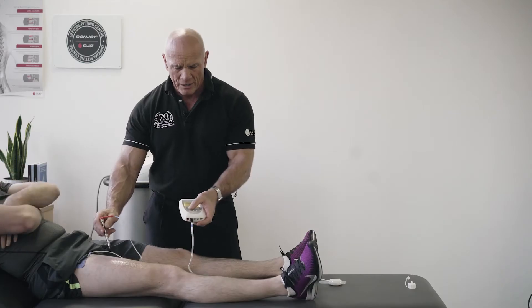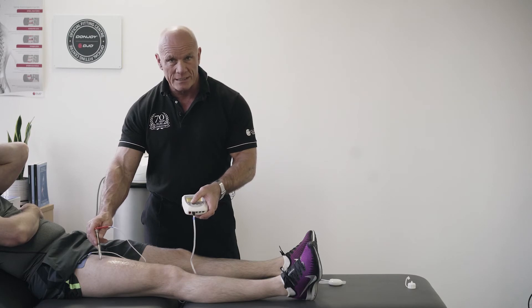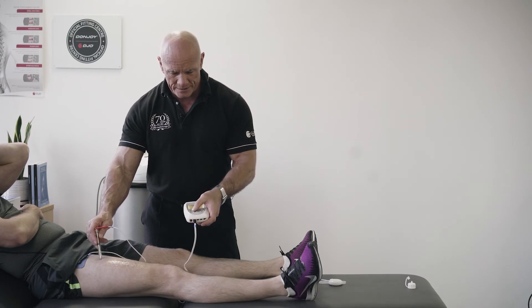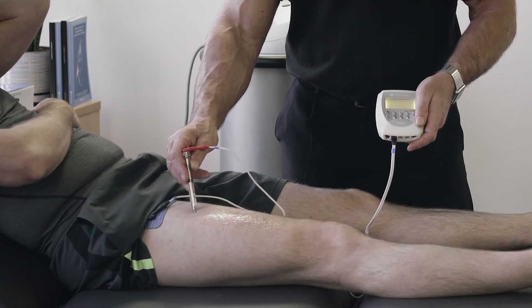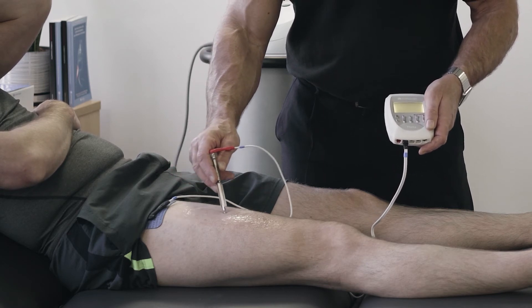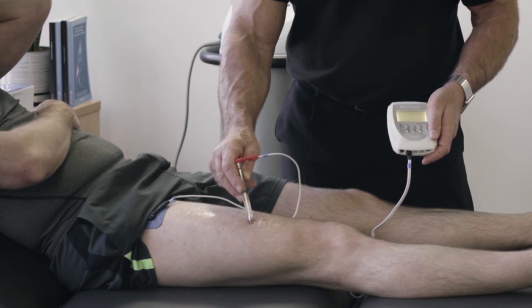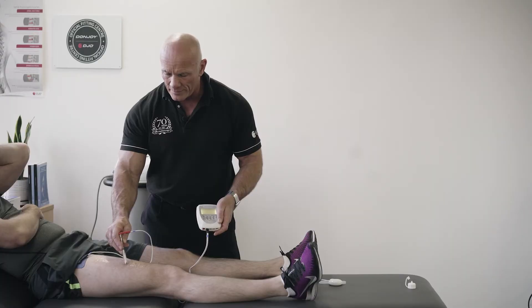You only need a small amount of intensity. I set it at around level five — this is not in milliamps. With some patients five might not be enough; with others it might be too much, so it's a good place to start. At level five, my patient can now feel a tingling sensation in the muscle, but we're not seeing any evidence of an action potential.